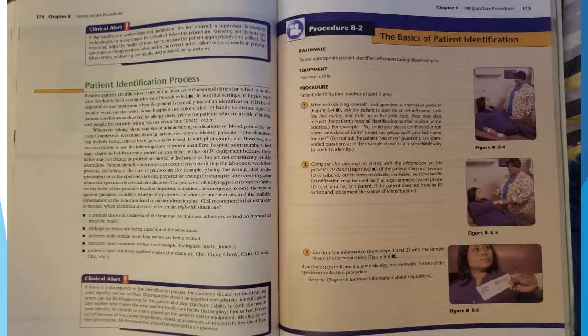Patient identification errors can occur at any time during the laboratory workflow process, including at the time of phlebotomy. For example, placing the wrong label on the specimen or as the specimen is being prepared for testing. For example, after centrifugation, when the specimen is divided into aliquots. The process of identifying patient varies slightly on the basis of the patient's location, inpatient, outpatient, or emergency room, the type of patient, pediatric or adult, whether the patient is conscious or unconscious, and the available information at the time, armband or picture identification.